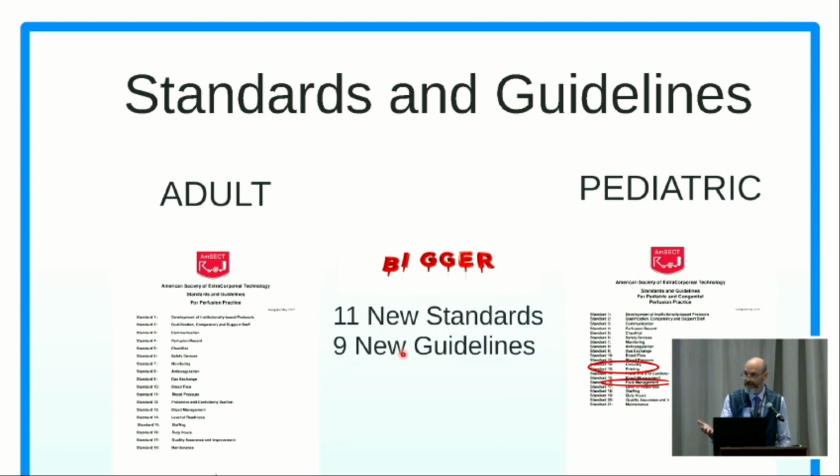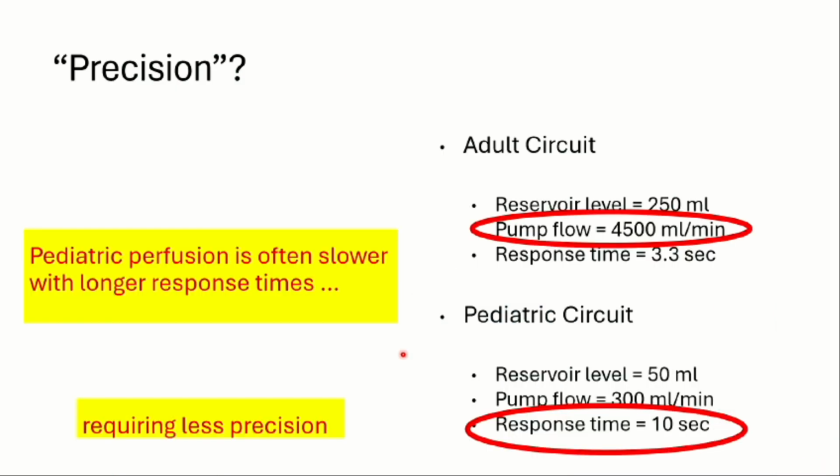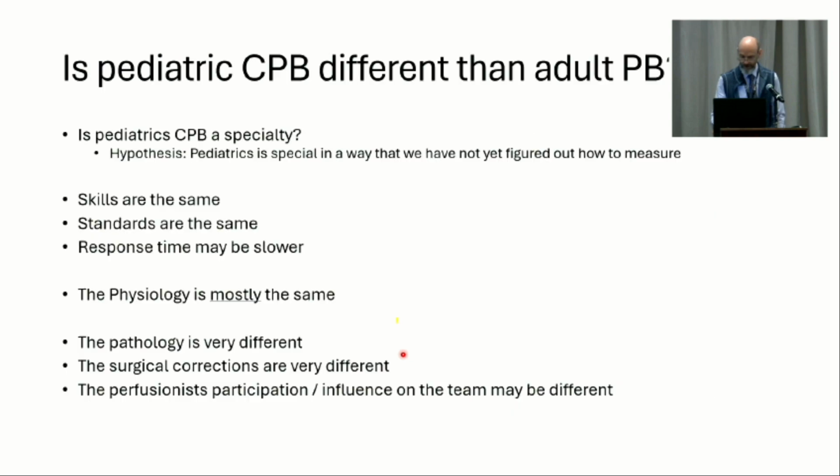So this is what you believe. I get it. I've heard conversations about, well, it's not in those things, Bruce. It's in the precision. And I just had a good conversation with a colleague over here, and he has some really good examples of how it could be precision. But then there's also really good examples on the other side where the precision doesn't work out in your favor. Like, look, my response time as an adult at 4.5 liters a minute could be much shorter than the response time you get on a pediatric circuit when you only have 50 mLs in your reservoir.